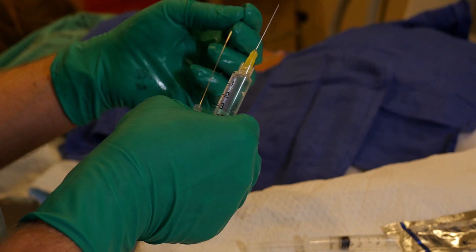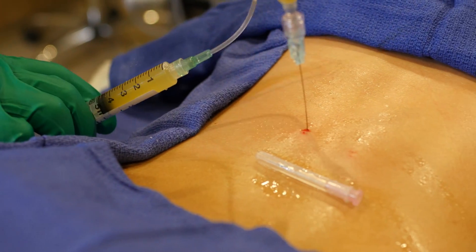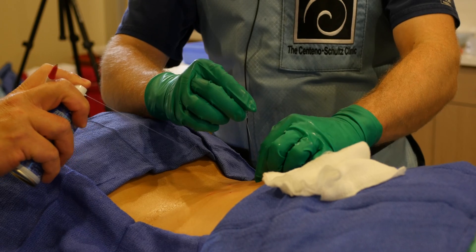We're going to do just two ligaments on the left, and this is also something different than most physicians do. Most physicians just look at structural defects, not so much the things that pertain to what's causing the structural issue.